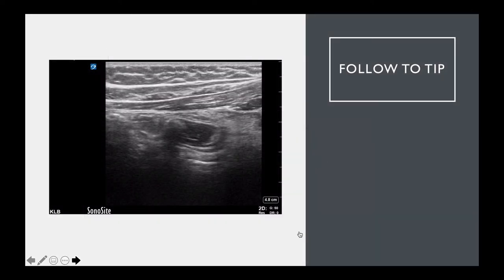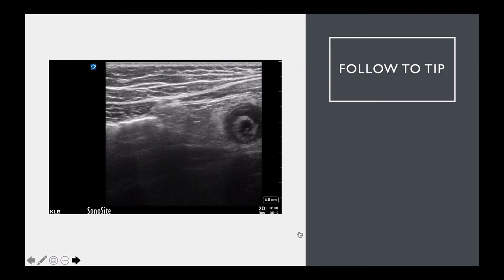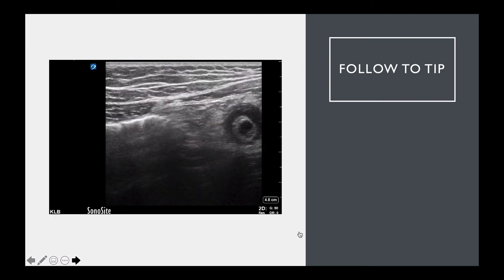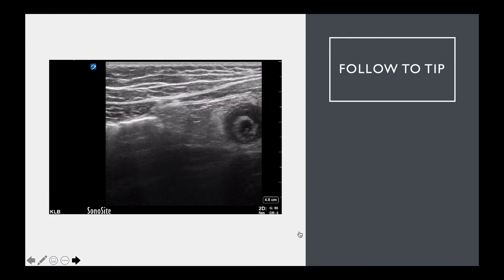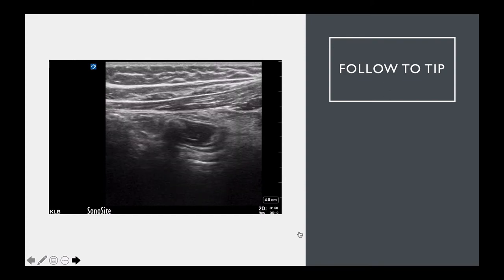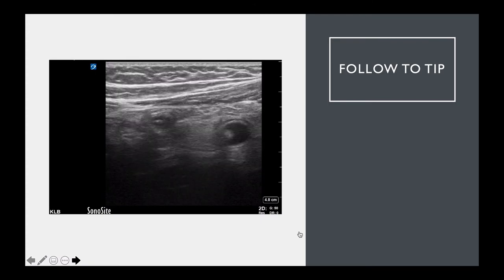As I said, it's important to follow it to the tip. Not all abnormal appendixes are straight, and there is such a thing as tip appendicitis. Watch this little clip here. On the left of the picture, you can see a pretty normal appendix diving down into fluffy white cecum. But you'll notice that there's a dark hole on the right with a break in the line of the lumen, and some bright fat around it. So this is a case where the proximal appendix was normal, but the distal appendix was quite abnormal.